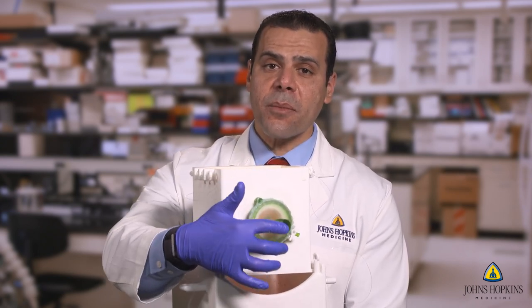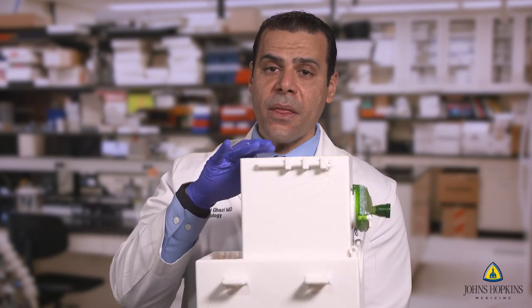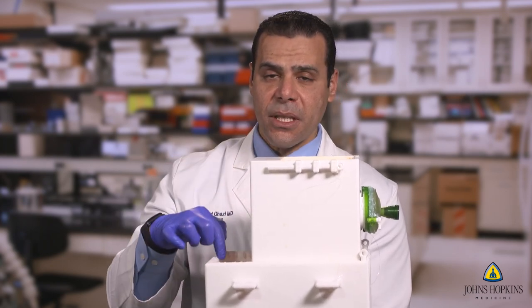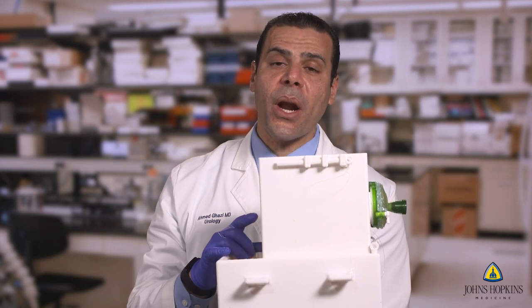This also withstands a significant amount of the tension required by the endoscope to do the enucleation. When the fluid gets filled up to a certain level, there are internal channels that fill the reservoir and it's pumped back into the endoscope. So this is a completely self-contained system for irrigation and practicing of the model.